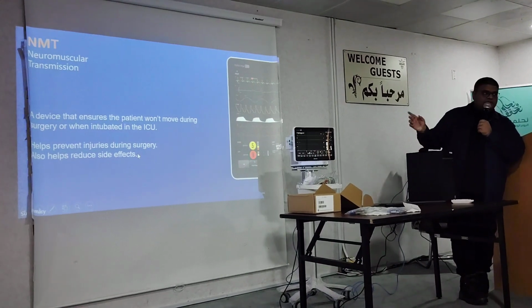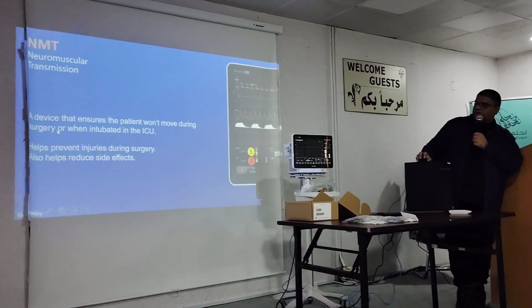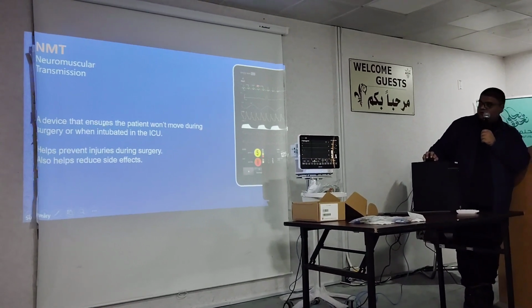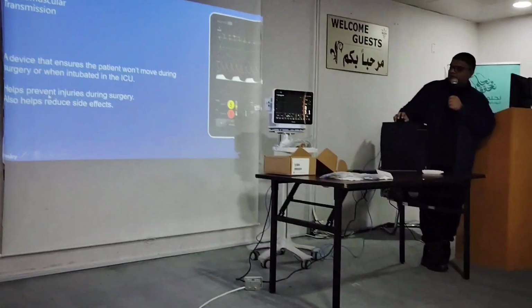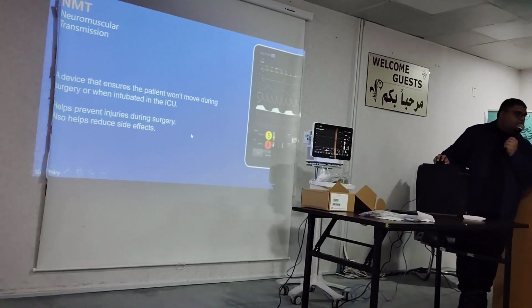So it's a device that ensures the patient won't move during surgery or when intubated in the ICU. This is the main use of this. It also helps prevent injuries during surgery. You don't want your patient to move, and it also helps reduce side effects, because you're not overdosing your patient.